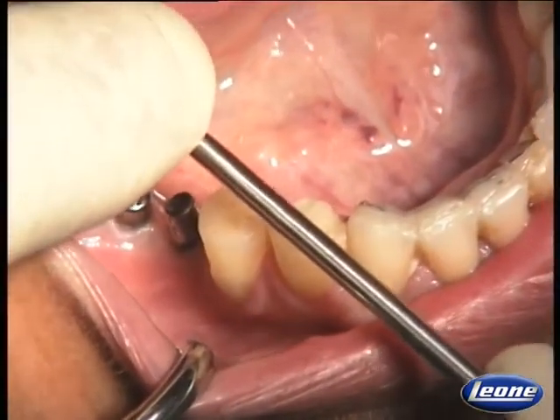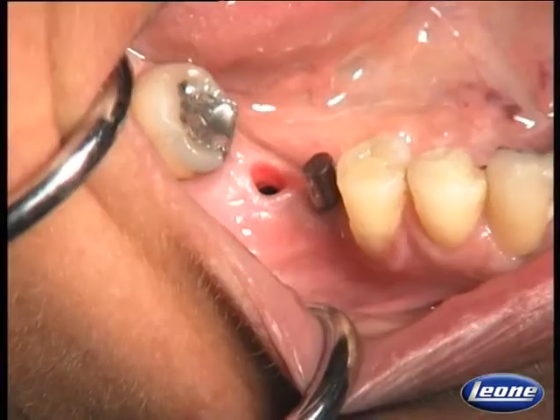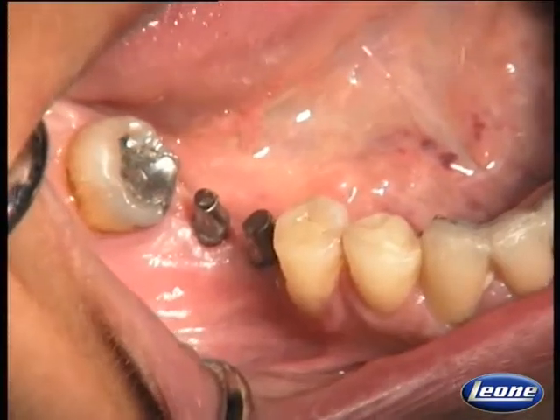We seat the extractor into the hex on the head of the second healing cap. Rotate for 1/2 turn and the cap is unlocked. We place the second abutment into the implant and push it all the way down and exert, again, finger pressure on it.